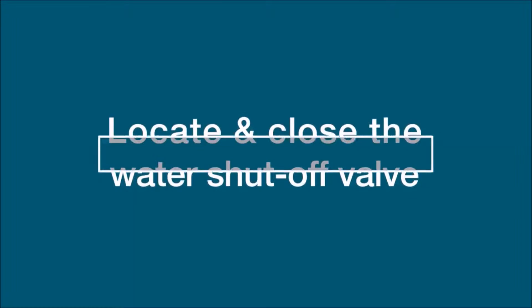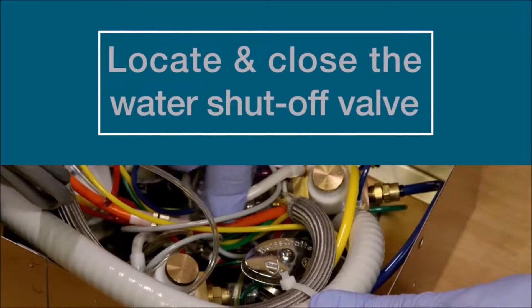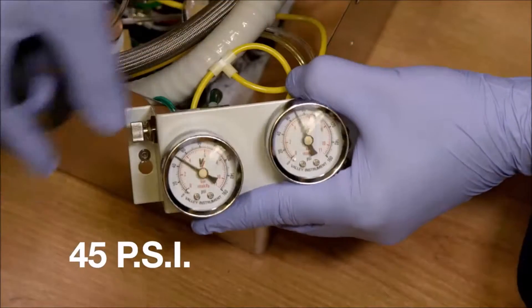To begin, you'll need to locate and close the water shutoff valve for the unit and set a pressure of 45 psi on the regulator.